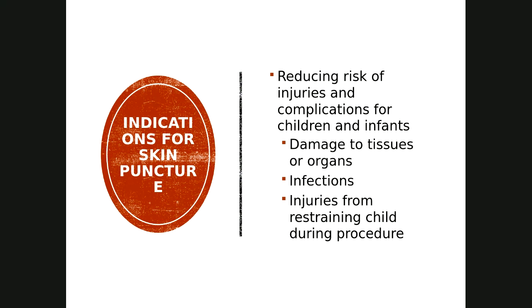Reducing risk of injury and complications for children and infants, damage to the tissue organs, infections, and injuries from restraining a child during the procedure. So because the skin puncture devices have a penetration recommended depth, there's less likely for damage to tissues, less likely for infection because it is generally a one stick and done procedure, and less likely for restraint because during these procedures, it's a lot easier to get a patient to comply because it's less invasive.